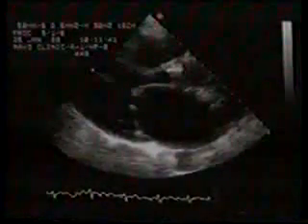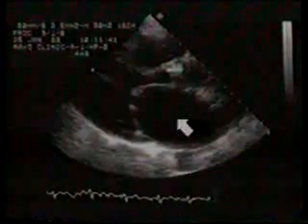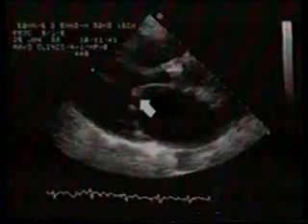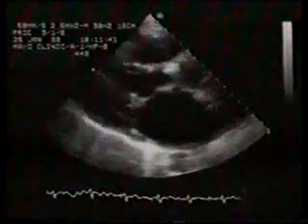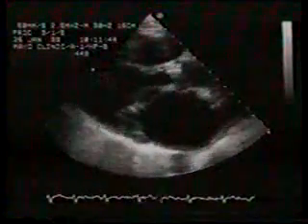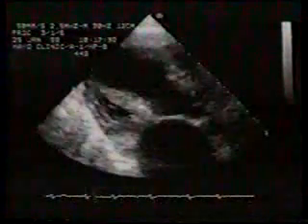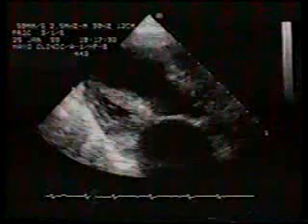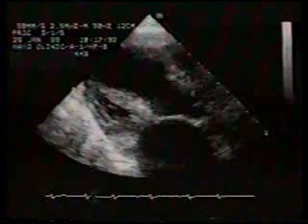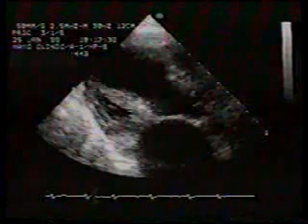This is yet another patient with mitral stenosis. The left atrium is enlarged. The mitral leaflets are thickened, and the diastolic opening is reduced. From the preceding long axis view, it would have seemed likely that we could simply rotate to short axis and planimeter the orifice and thereby accurately assess the degree of stenosis.